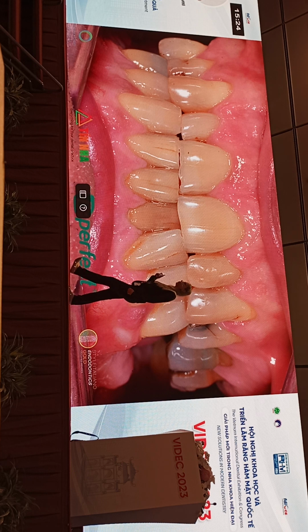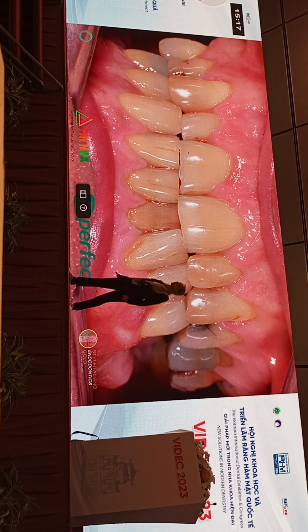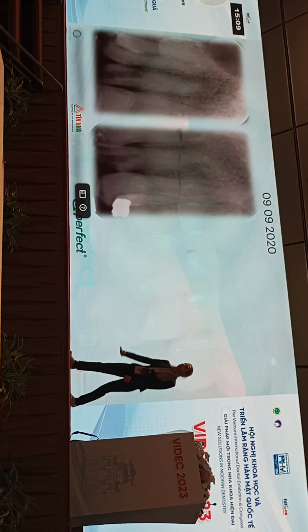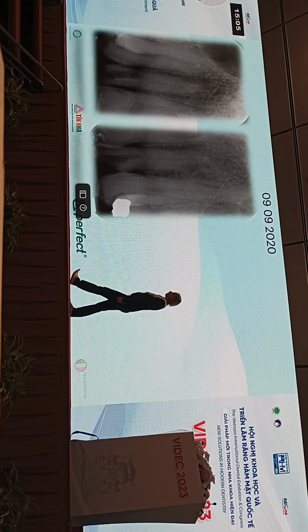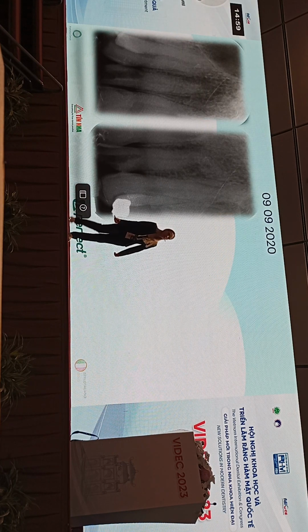And he tries to find the root canal in one tooth, and he doesn't, so he stops. He tries to find the root canal in the other tooth, and at a certain point the assistant keeps kicking in and says, "Stop, doctor." He stops and sends the patient to me. This is the preoperative that I do. The inclination was completely wrong. I think he perforated there.